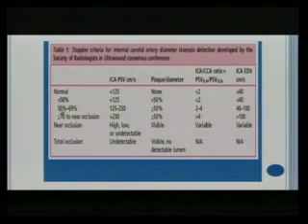Now coming to the next category, which is 50 to 69%. Why is this categorization? This categorization has happened for two reasons. Number one, the vascular surgeons or the endovascular neuro interventionalists follow this very strictly. They will not intervene in the 50 to 69% category unless the patient is symptomatic, unless the patient is having TIAs or there is some aberration in carotid function. So 50 to 69% intervention is only reserved for symptomatic patients. In that category, the peak systolic velocity is above 125 but below 230.